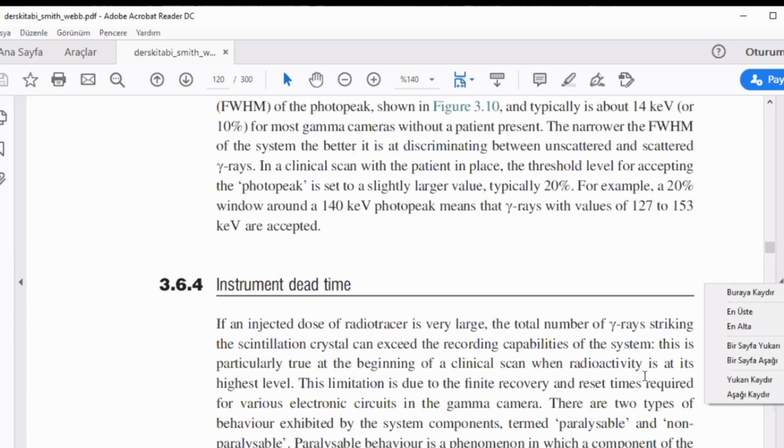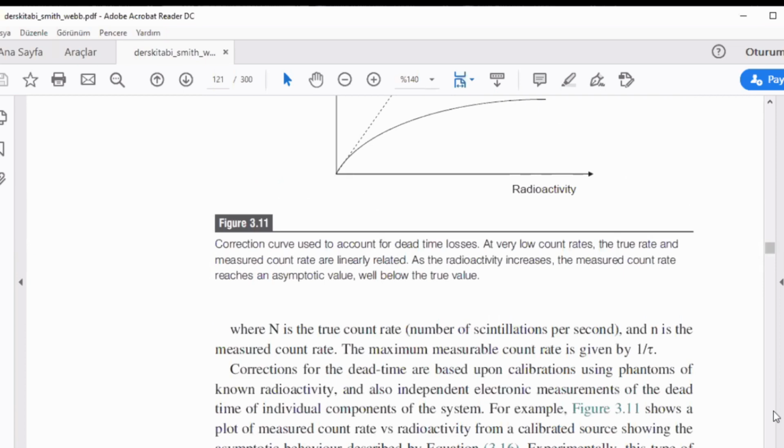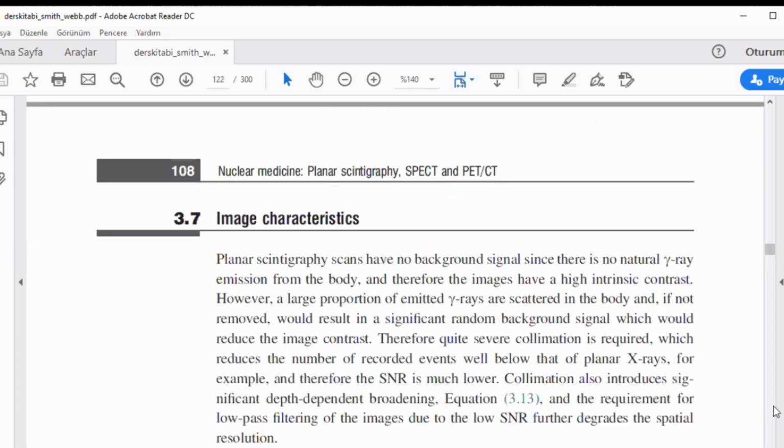Due to scattering, etc., there may be some delays in the, let's say, scintillation moments. Those other types of subsystems are a bit detailed, so I'm omitting those, left as a reading exercise.